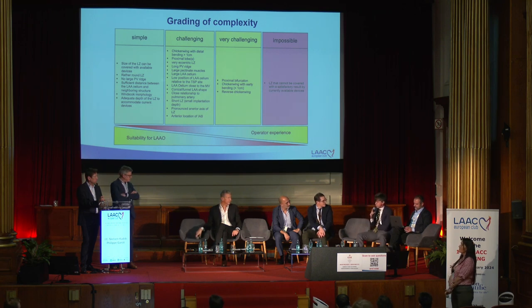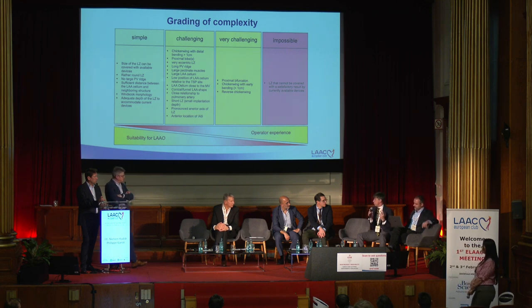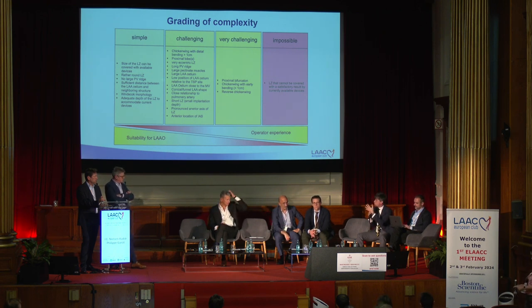I totally agree. But finally, the point of this is to try to make something simple and, if possible, before the procedure. We need to anticipate that the puncture is going to be inferior and posterior, and we need to work on something simple. And I'm quite sure that if I saw an image of an appendage, most of us would agree if it's easy or complex. So what we are trying is to translate that into something.